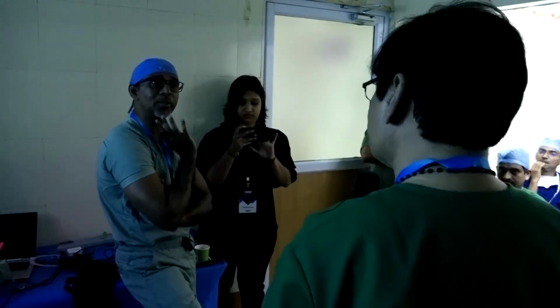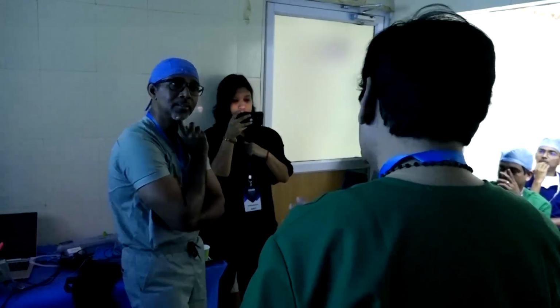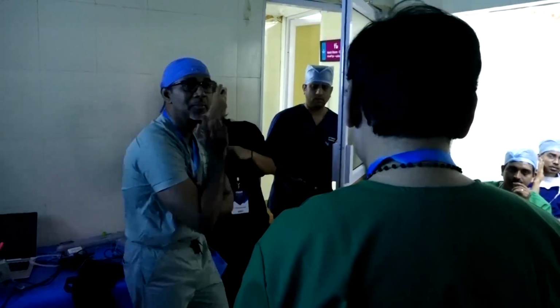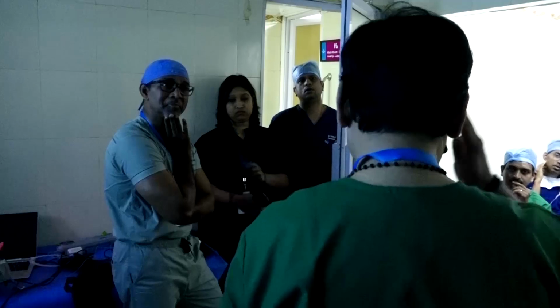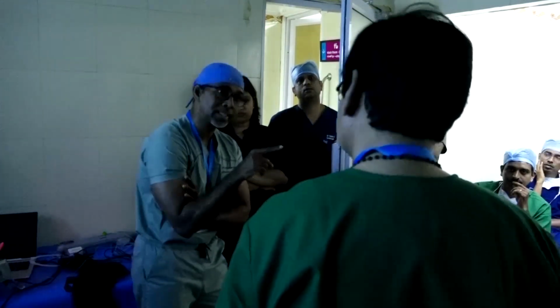Suppose I treat 10 nodule cases, I have seen 2-3 cases that I have to send for surgery. That's why, whenever my strategy is only IVL for the nodule, I do not advise it. I always do atherectomy. That's why Dr. Kashim also said, reduce the volume.